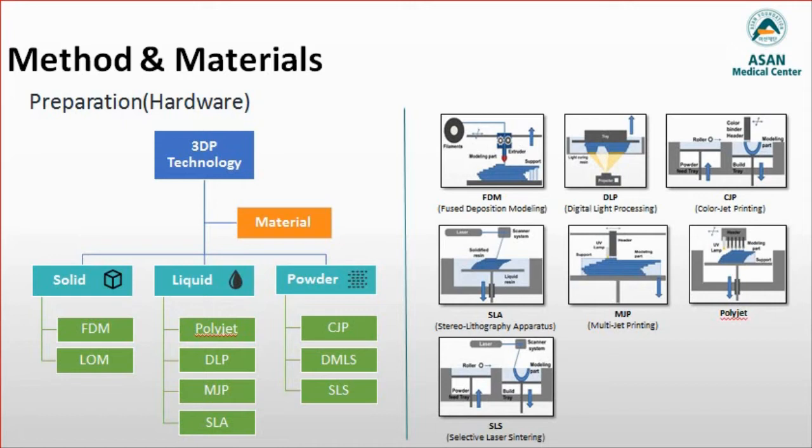The solid-based 3DP technology of FDM typically uses a similar principle to SL in that it builds models on a layer-by-layer basis. The main difference is that the layers are deposited as a thermoplastic that is extruded from a fine nozzle.